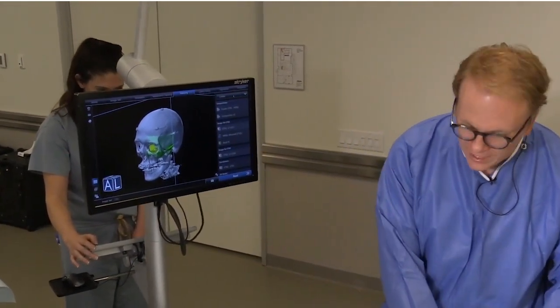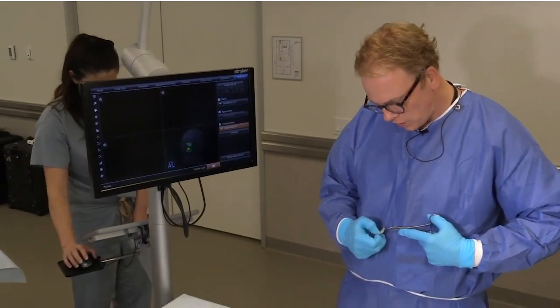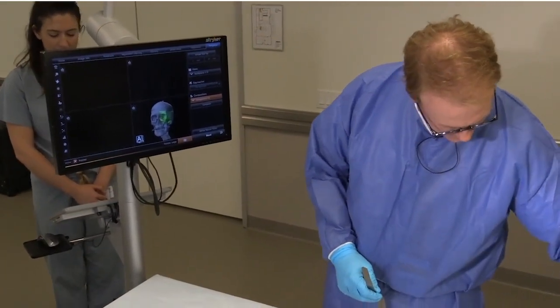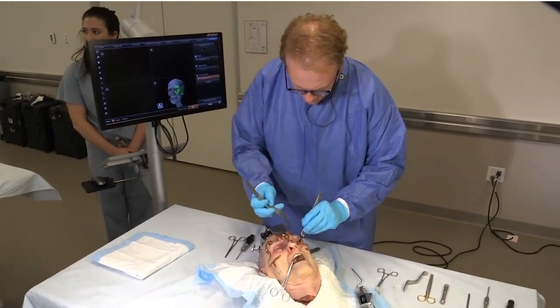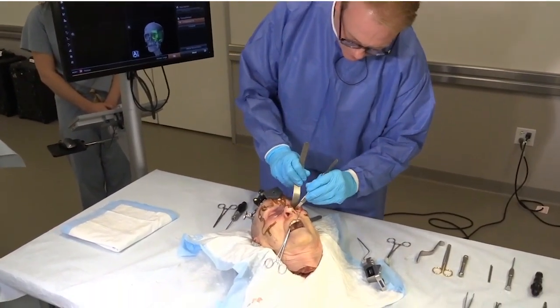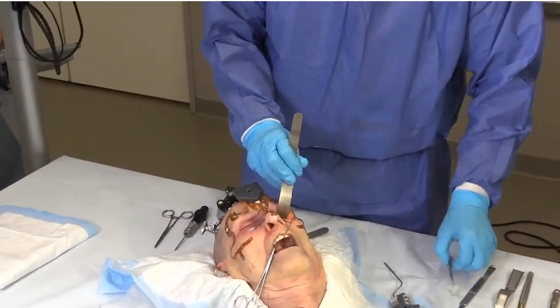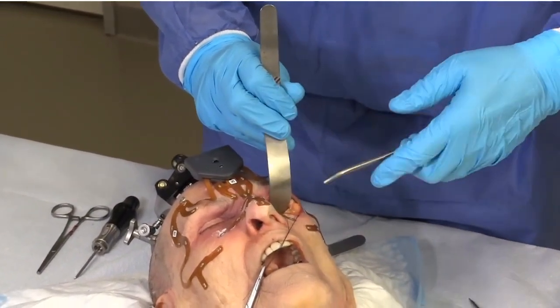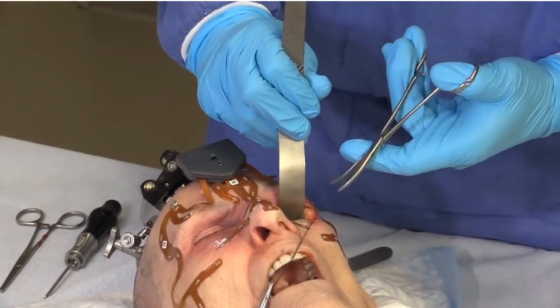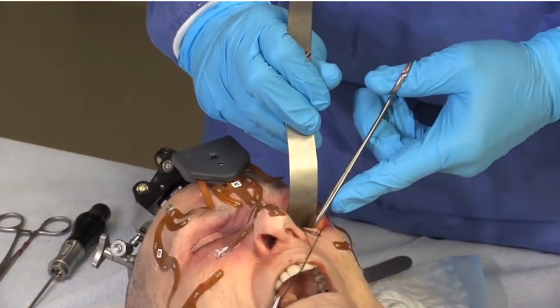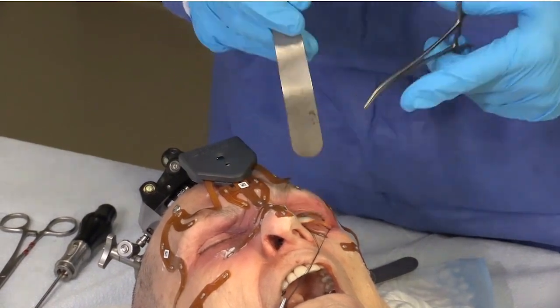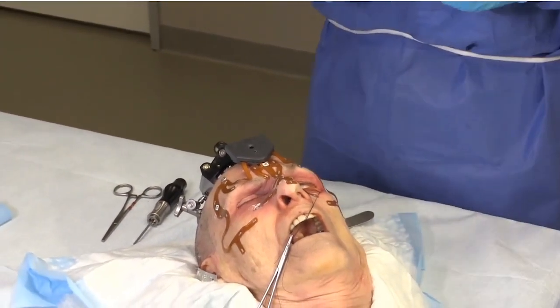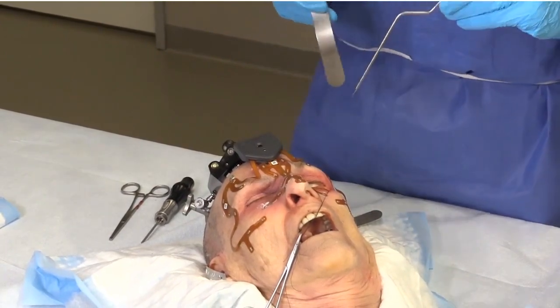The next step after having already dissected the orbit and found solid bony anatomical margins — in particular identifying the posterior lip of the fracture — is to expose the fracture itself, take my implant custom designed for this defect, and place it into the orbital defect. Make sure it's sitting on firm bone, and then essentially I take my best approach, the same way I would fix an orbit fracture if I didn't have navigation available.